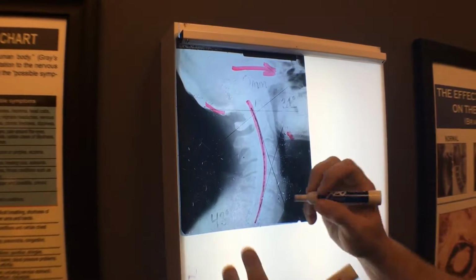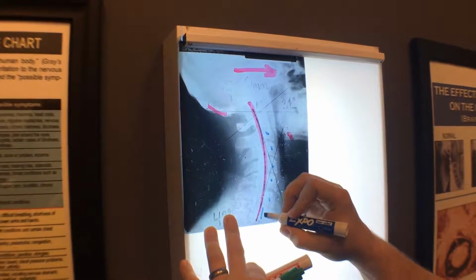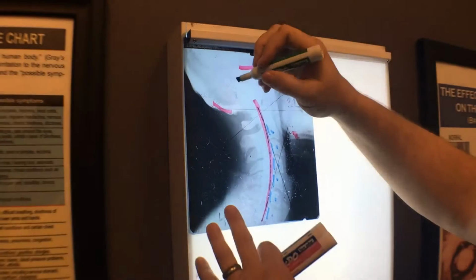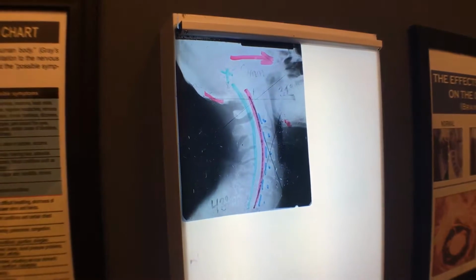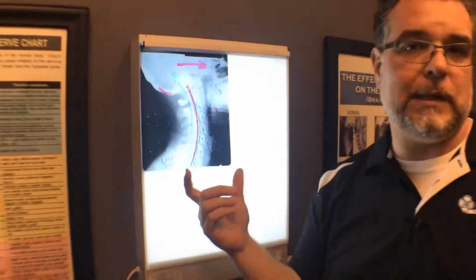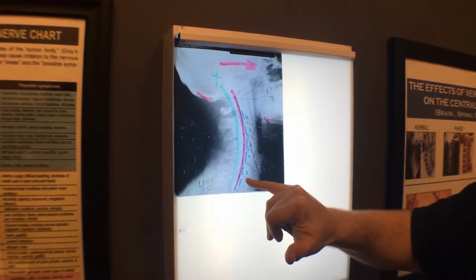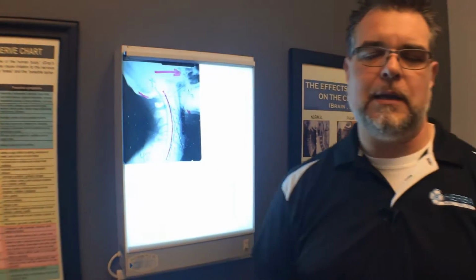The next thing we do is on the back side of every one of these bones inside, we actually draw a blue line. And that blue line should match the red line real close. And the reason why is because the brain, which sits up here, sends information down the spinal cord across there, telling the body to heal and do what it needs to do. So as long as you keep this in the right position, the body will work the way it's supposed to. So when you look at an x-ray, you want to see blue line match red line. Blue line is where you are, red line is where you're supposed to be, and you want to see thick, even spaces in between.